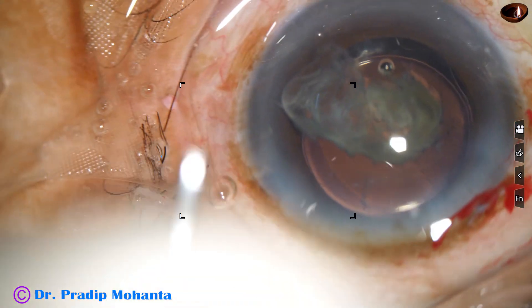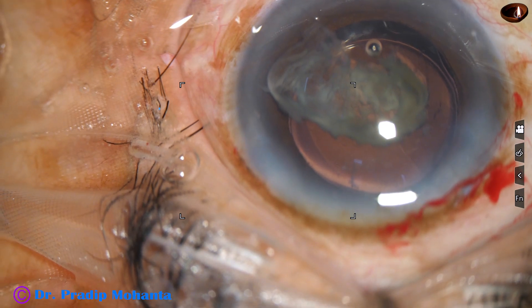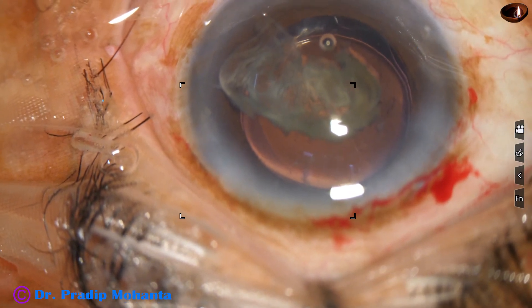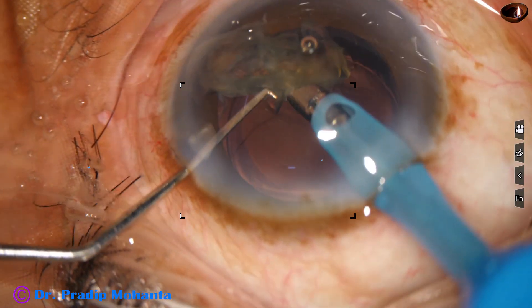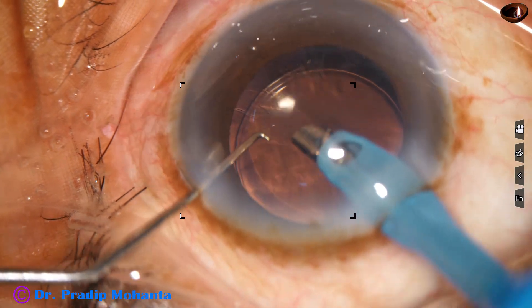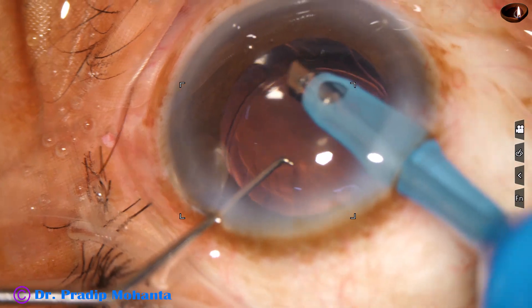I take the phaco needle again and emulsify the epinucleus. At this time I am in phaco 3 mode, where ultrasonic energy is 50%, flow rate is 30, and vacuum is 300. The epinucleus shell is emulsified.